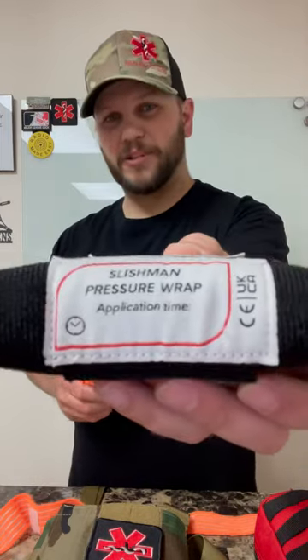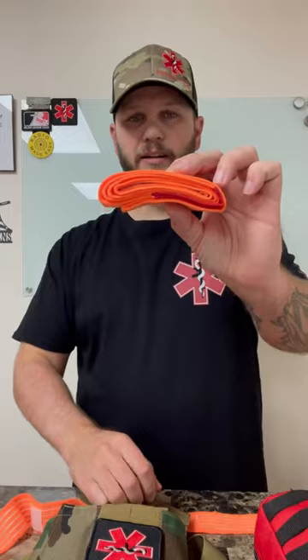This is a new product on the website — really excited about it. It's called the Slishman pressure wrap. It can be used as a pressure bandage and can also double up as a tourniquet. This is how they come if you buy them new, or they come in a fancy little pouch if you want the pouch.